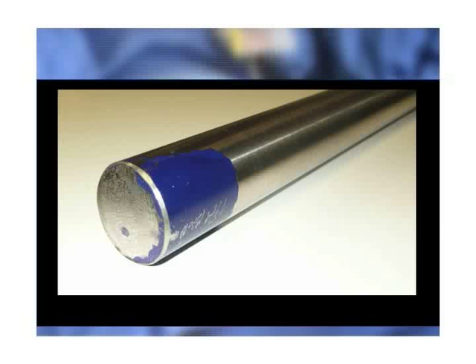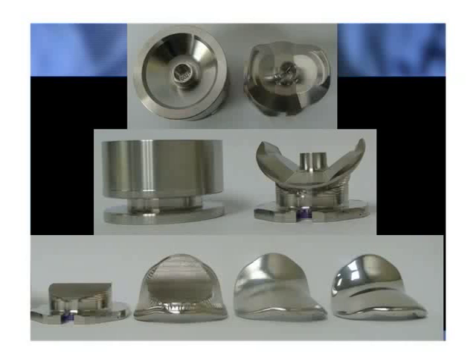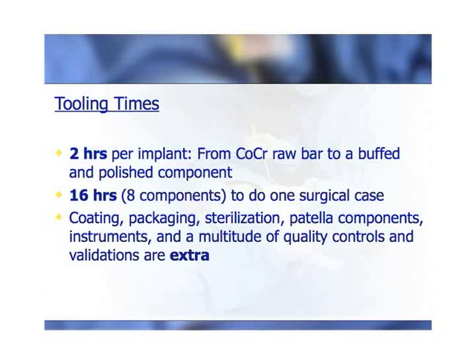This is how they all start. They're bars of cobalt chrome, and then going from left to right, we get closer toward the finished product until it's finished at the end. It's a very time-consuming process that one has to appreciate, and this is what allows us to make these implants thin and durable.